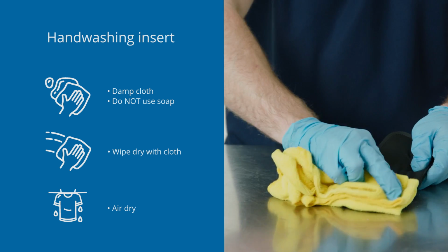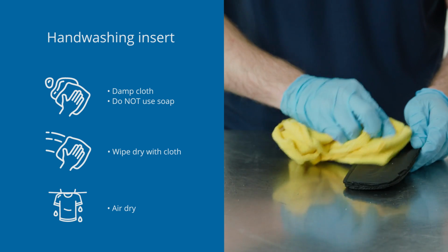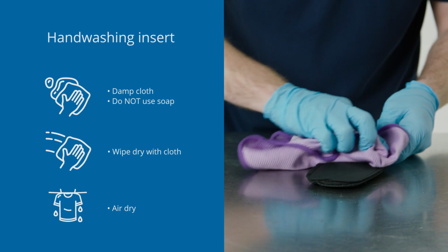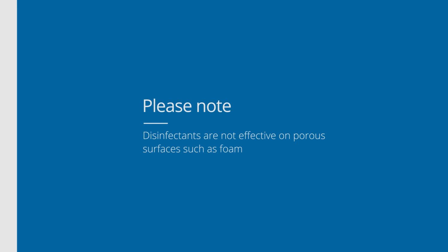For cleaning the inserts, wipe lightly with a damp cloth, making sure not to use a soap. Wipe the inserts off with a clean cloth. Allow to air dry flat completely. Please note that the disinfectants are not effective on porous surfaces such as foam.